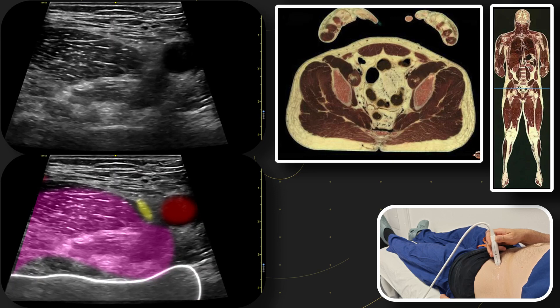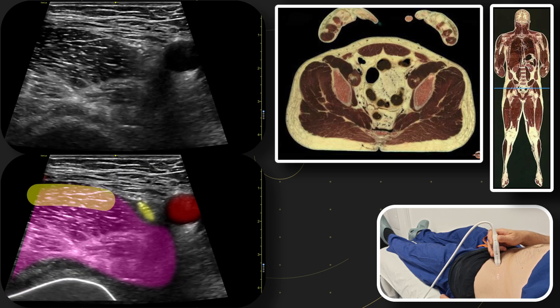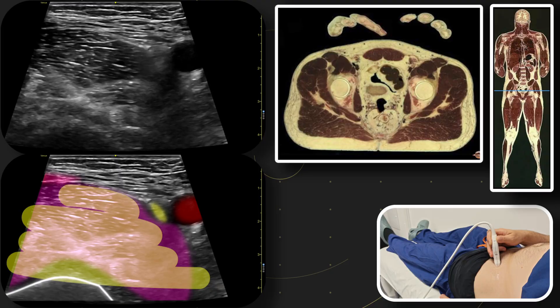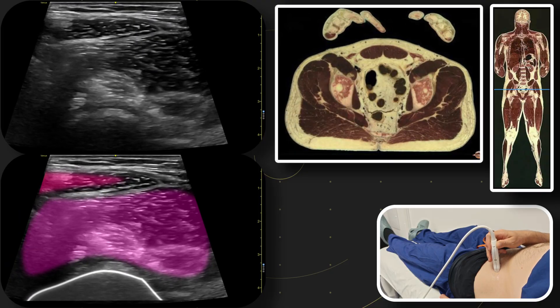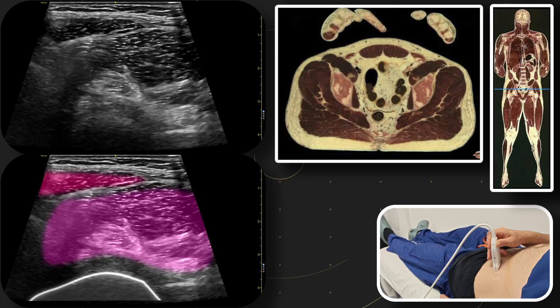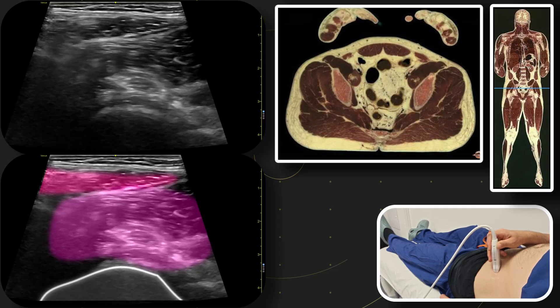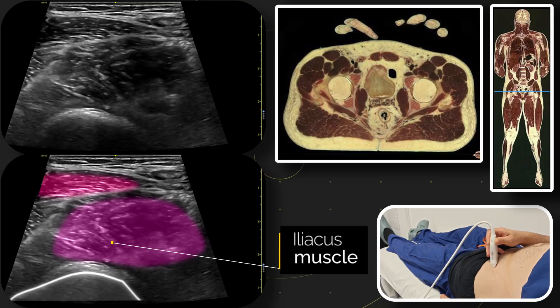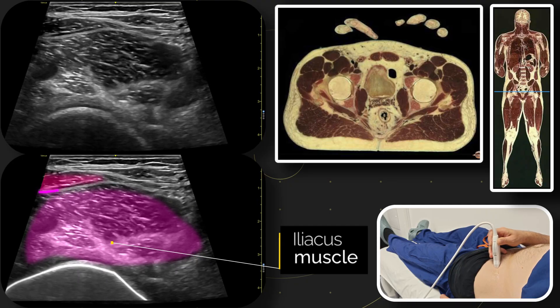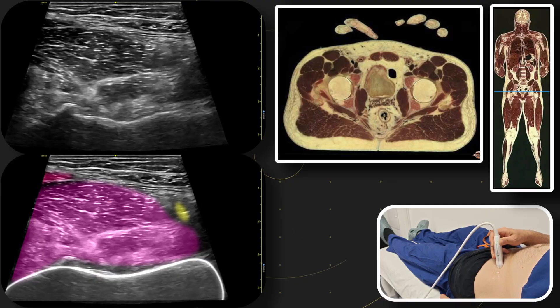The next thing I'm looking for isn't the nerve — it's the iliacus. We want to see what this muscle looks like, and then we want to see what the fascia iliaca looks like. We're going to use these as references, because surprisingly often it can be difficult to see the femoral nerve initially, and this is the case in this scan. Here's a nice view of the iliacus muscle, and we're going to focus on the fascia iliaca above it.